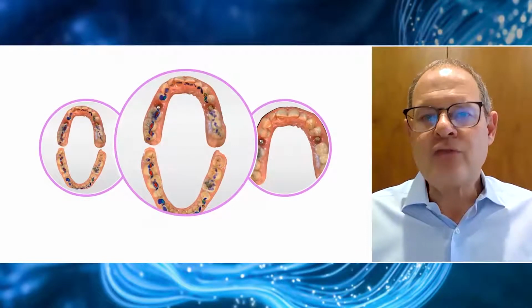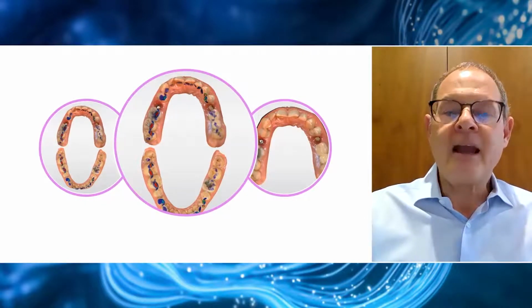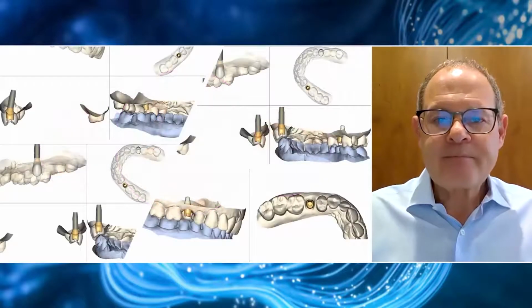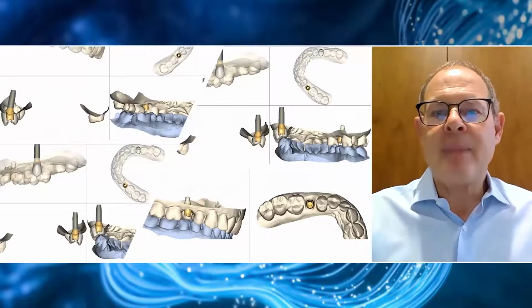And so I do think that these intraoral scanners may be a very valuable tool for encouraging patients to improve their mouths further. And again, this patient we took to the virtual abutment design for Atlantis custom base abutments.